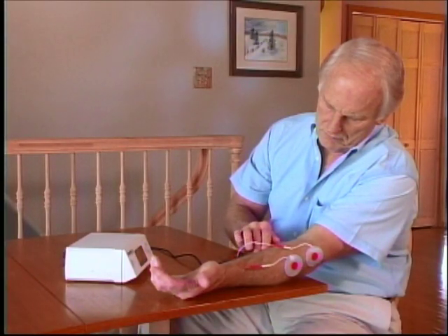For our first example, watch the NeuroMove work with the wrist and fingers. This brain retraining process begins with your mental concentration on moving the muscle group in question — in this case, the forearm. All you do is make a concentrated attempt and imagine you are moving the muscle group. The NeuroMove is so sensitive it will pick up your attempts even below any prior voluntary movement.